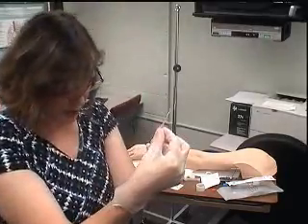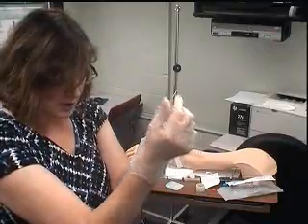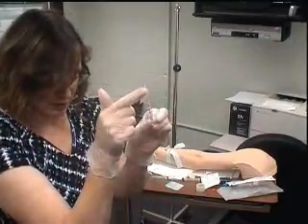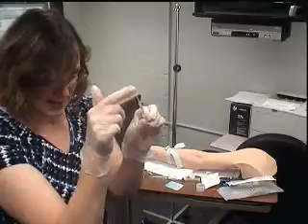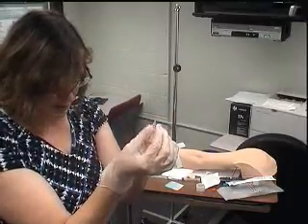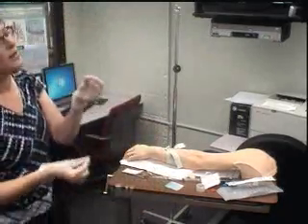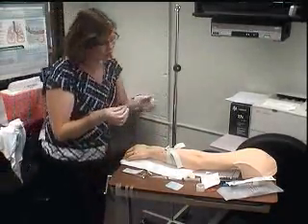I don't know if you can see this really well, but the needle is on the inside. The catheter is over the needle, so it's an over-the-needle catheter. This part stays, and don't touch it on a real person, but this part is what stays inside the patient where the needle comes out. Like I said, some people just loosen it up a little bit and then push it right back down, but please don't thread it all the way off and then try to rethread it. That is a big no-no.